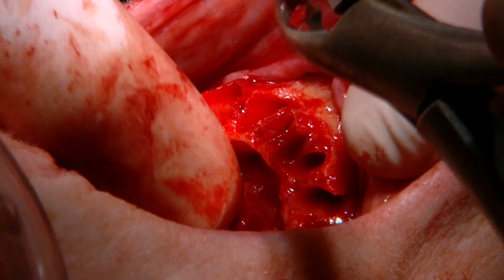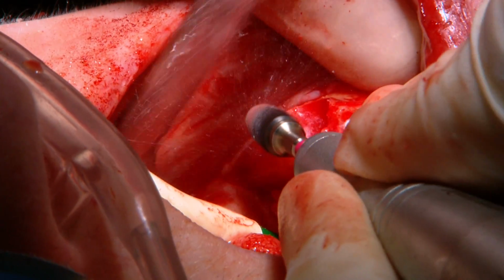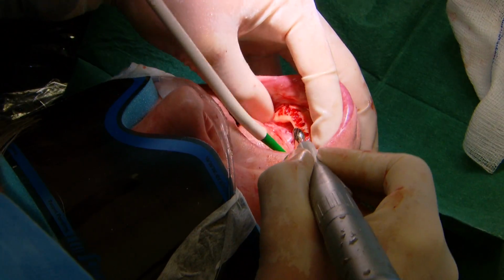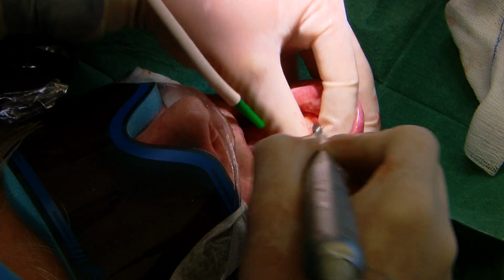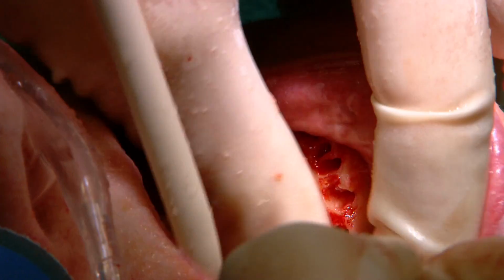It's mashed up and we use it as a bone graft at the end of the procedure to fill in all the deficits in the bone. Last but not least, we just level it all off and make it nice and flat. So after the alveolar bone is made nice and flat, you can see how much flatter and neater that is. There's still just the tips here where the tips of the roots were, but you can see how that's going to form a nice flat fitting surface the whole way along.